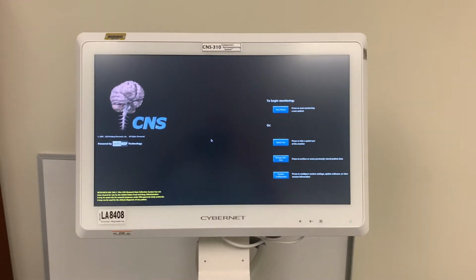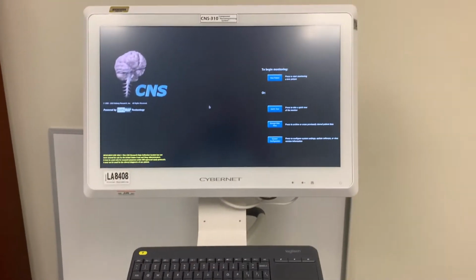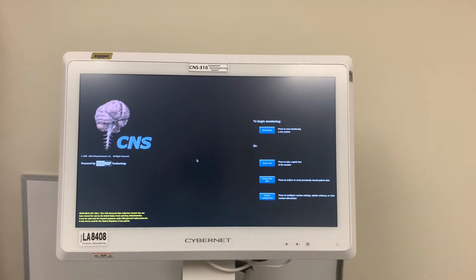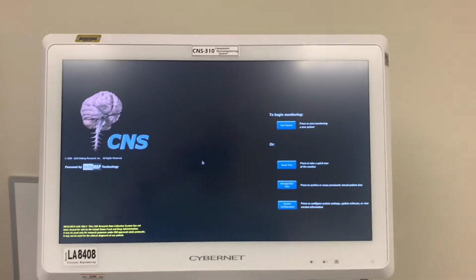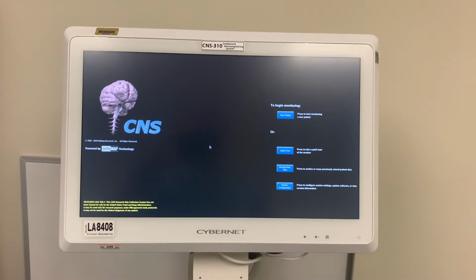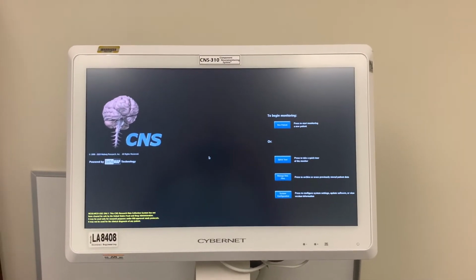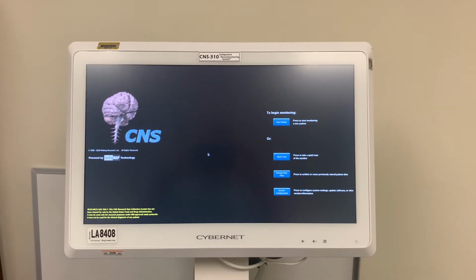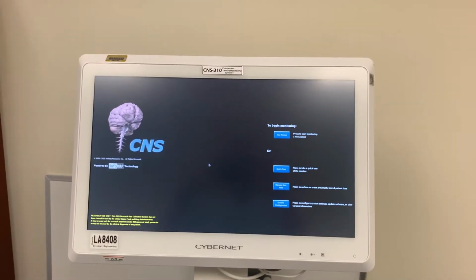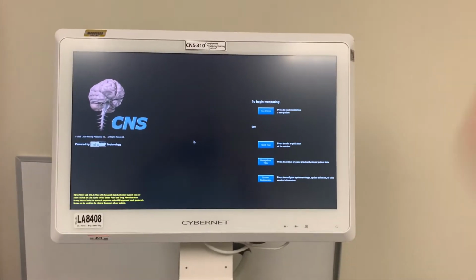When a patient is enrolled in the trial, they will also be hooked up to the monitor that you see in front of you, which is referred to as a Moberg CNS monitor, which is a multimodality monitor that looks at everything from blood pressure, oxygen, all the way to ICP and brain oxygen. It's an integrative monitor that allows us to not only see what's happening with the patient, but also gives us an algorithm by which we can help the patient through their ICP spikes and their low PbO2. So this is an introduction to the monitor and how it works and what you'll be seeing at the bedside.